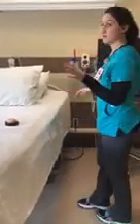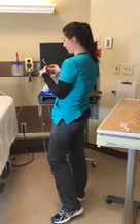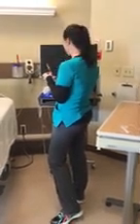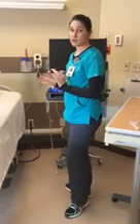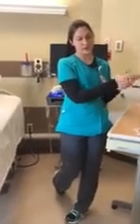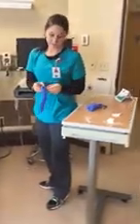No. Okay, so I'm going to go ahead and check that against the MAR. And I do have 0.4 mils of my Lovenox. It is Bob Johnson, correct name, correct date of birth, and I do have the correct dose with the 0.2 mils air. So the next thing I'm going to do is wash my hands. And Bob doesn't have any allergies on the MAR. I did check that one as well. I'm going to dry my hands. I'm going to put my gloves on.